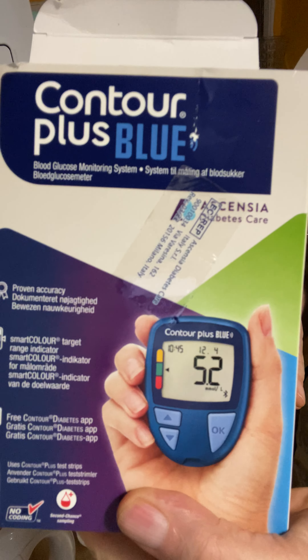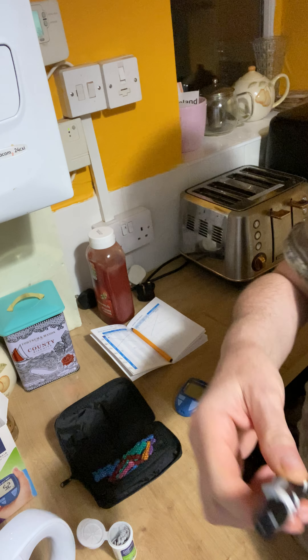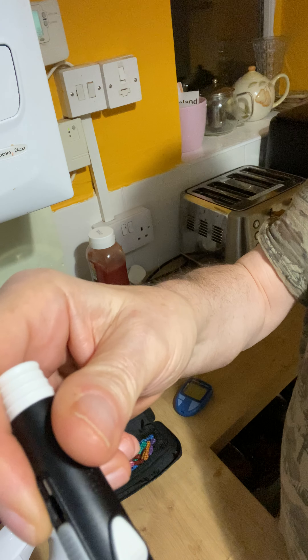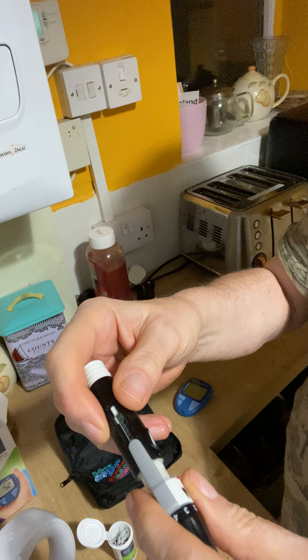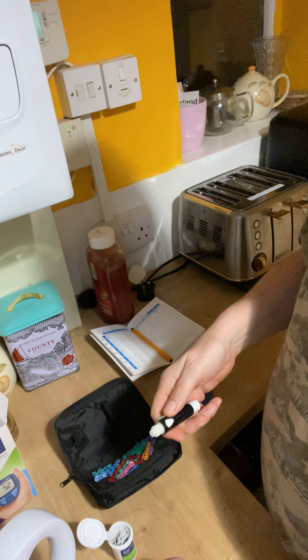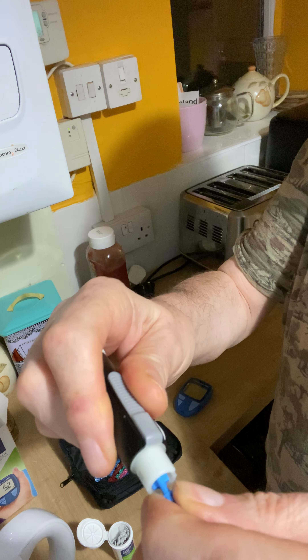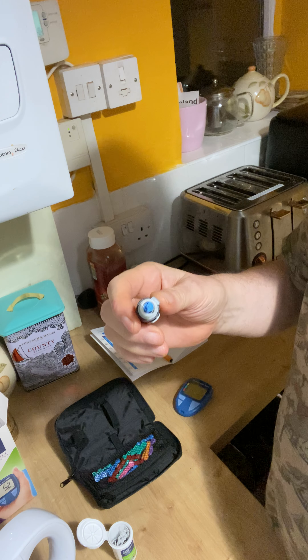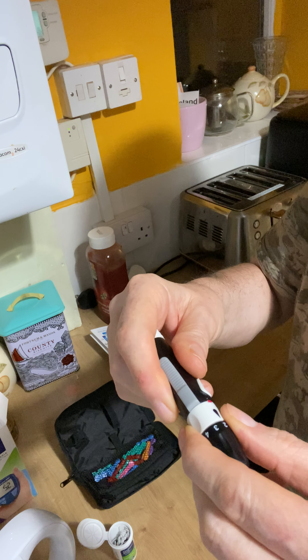How to use one of these blood testers to test your blood. One of them comes apart — there's a little groove there. Turn that to the groove, like that, see that? Take it apart. Take the tab off the top, put this back together, back on the groove, like so.